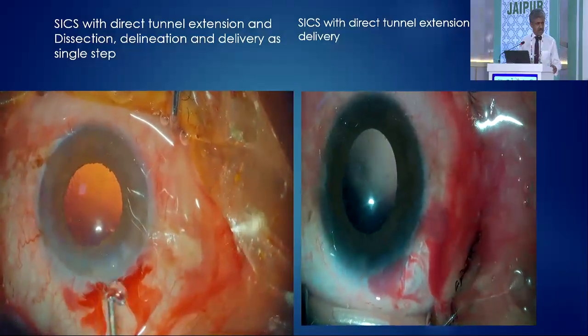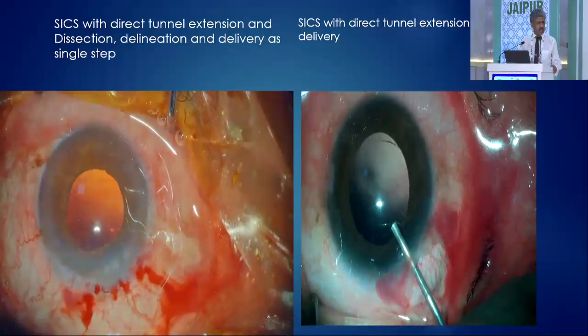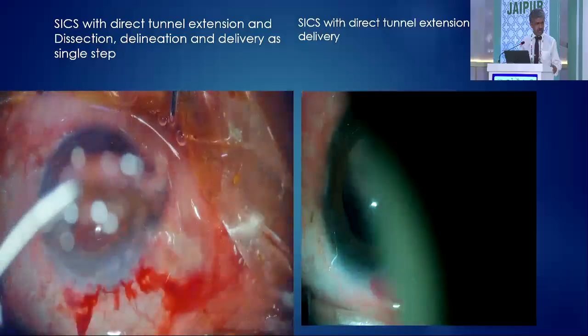The surgery is almost completed. That is the beginning part, and now it is the implantation turn.